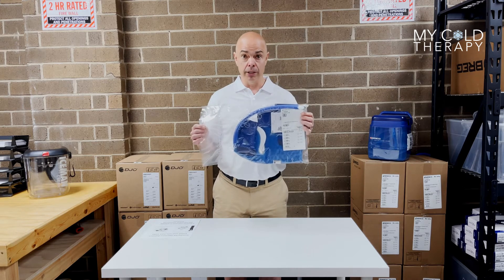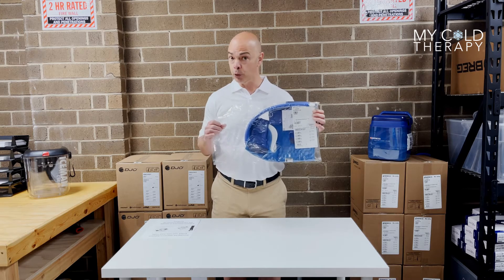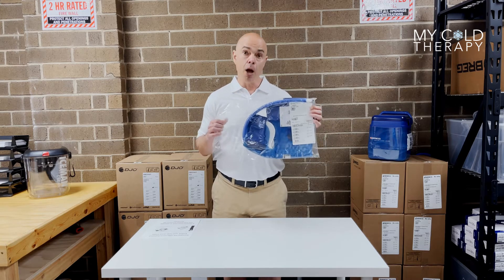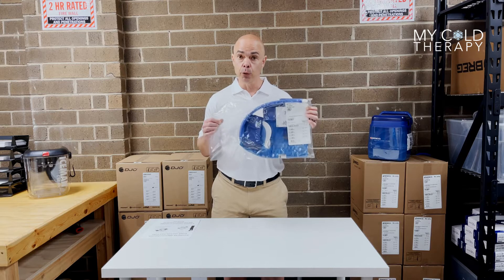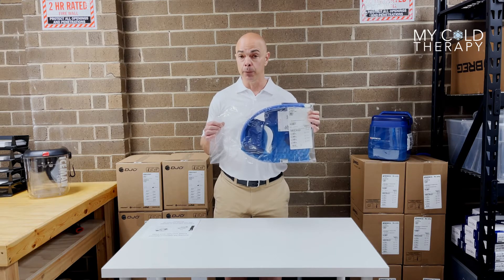Notice this pad comes sealed. This is very important because most of our customers are surgery patients. This cannot be opened because of the risk of infection. So unfortunately, if you open this bag and it is the incorrect pad, you're going to be unable to return it.